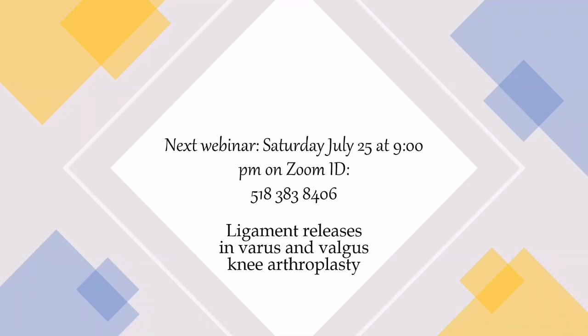Actually, most of the PS designs have high flexion, especially the Zimmer high flex, and also the J&J and the Amplitude. All of them have high flexion, so they like it. And most of the patients have been stable in deep flexion. So I prefer the PS designs.